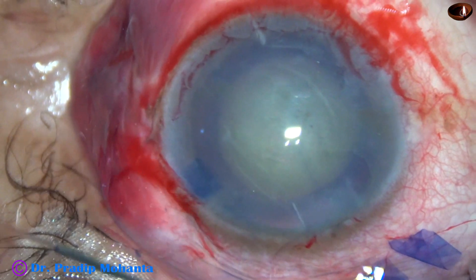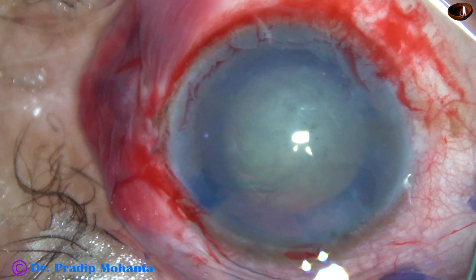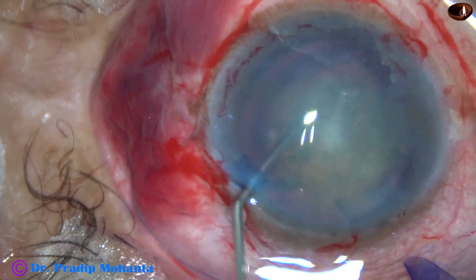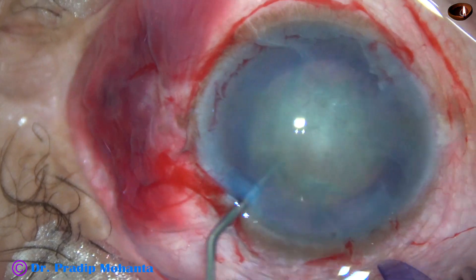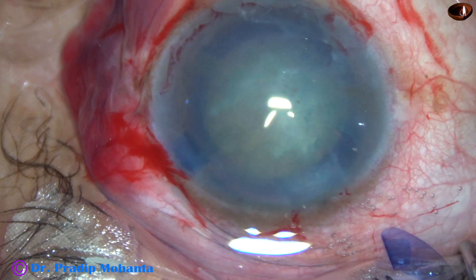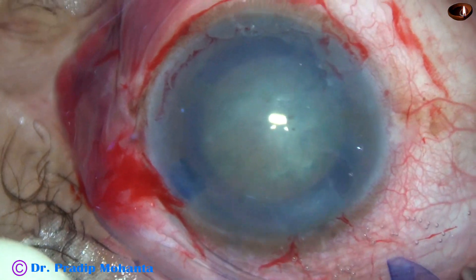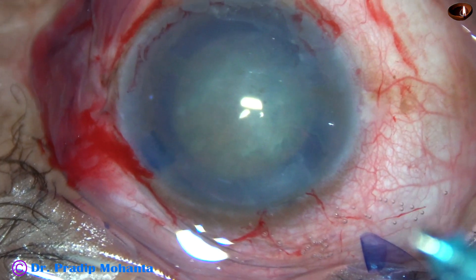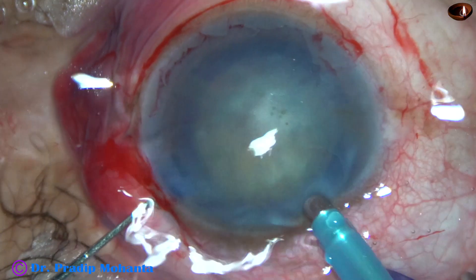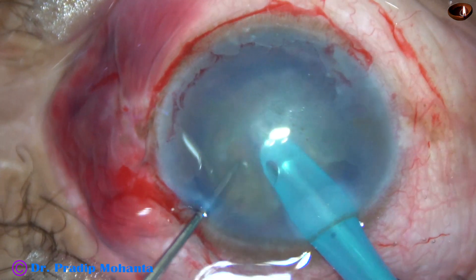Now we can see that the cataract is not soft — it is a quite hard cataract. Nuclear sclerosis is about grade 4. I am doing hydrodissection. Nuclear rotation is done. And now is the time to introduce the tip of the phaco needle. Irrigation is on, and some superficial cortical lens matter is removed.